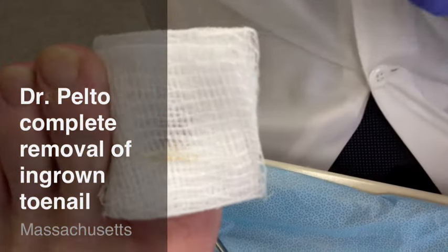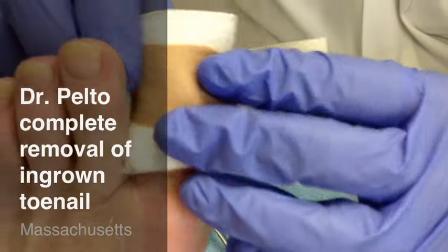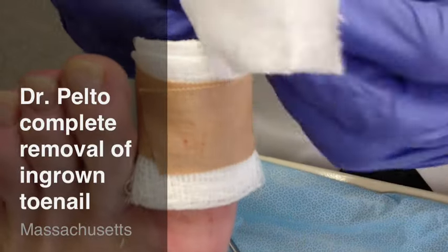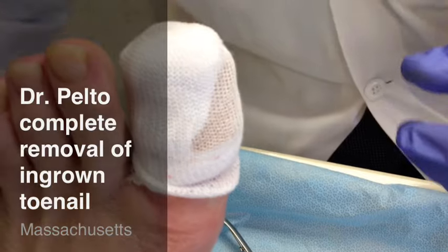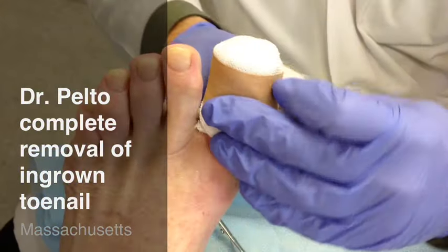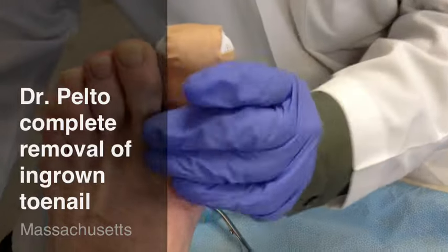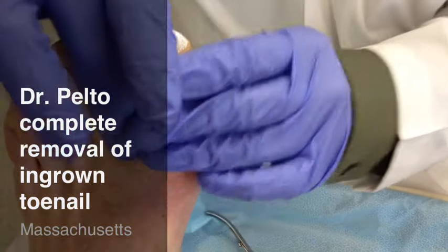Cover it up, and then put on a couple of pieces of tape. This is removed tomorrow, and it usually is best to take this off while soaking it in water or saline. That will allow it not to stick, because occasionally it can stick and become a little painful. And this is what we do for an ingrown toenail. It's better to go see a doctor sooner than later, especially with an infection, if you need to be on an antibiotic. Thank you.